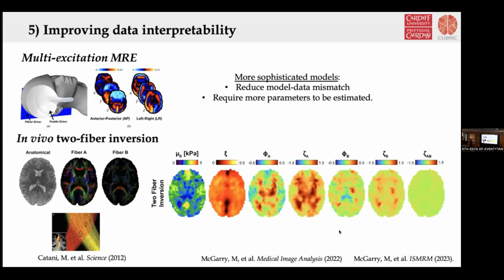Yeah, I wish I had a slide of the simulations I performed. I used a realistic brain model and looked at specific regions of the cortex that are affected primarily in Alzheimer's disease, even reducing the boundaries and things like that. With the ground truth, the recovered result was excellent. That was just my study, but the people who work on this on a daily basis, the engineers, it's very well validated on their side.